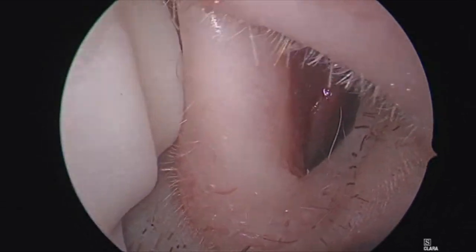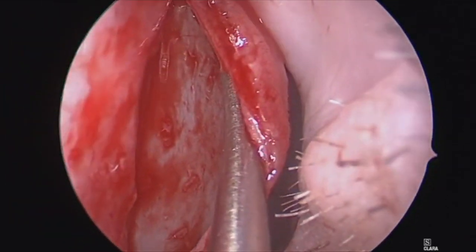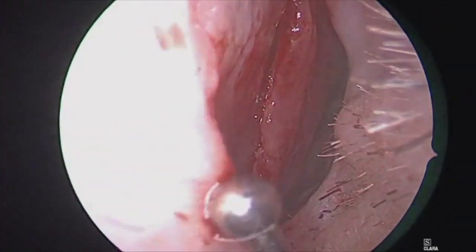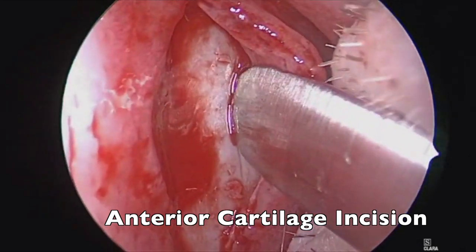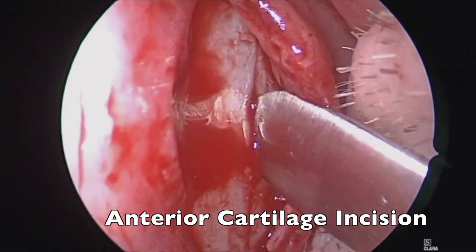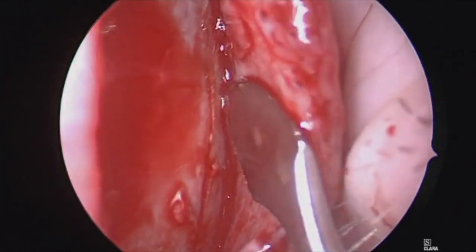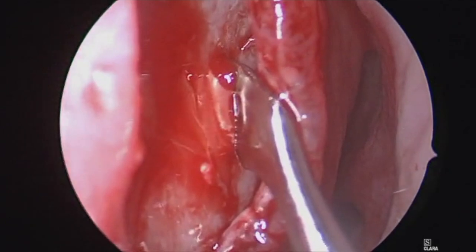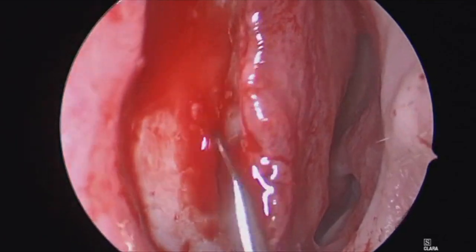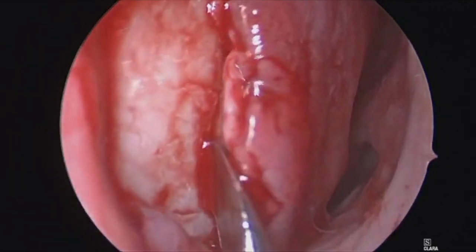Here we are showing the most caudal aspect of the nose and the caudal edge of the septum in comparison to where we would make a proposed cartilaginous incision. Ideally, you'd like to leave at least a centimeter and a half of caudal strut, making that vertical incision with a sharp freer elevator through the cartilage itself, and then beginning to raise the contralateral flap without coming through the mucosa on the contralateral side. We staggered our cartilaginous incision from our mucosal incision, which provides extra protection to ensure no healing issues when we close the incision at the end of the case.